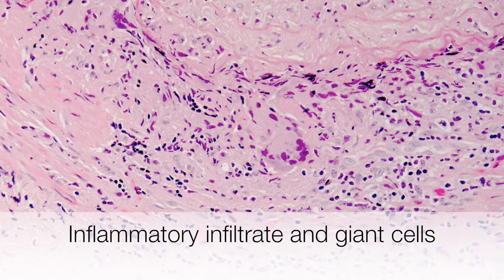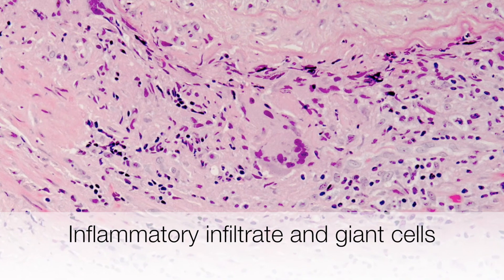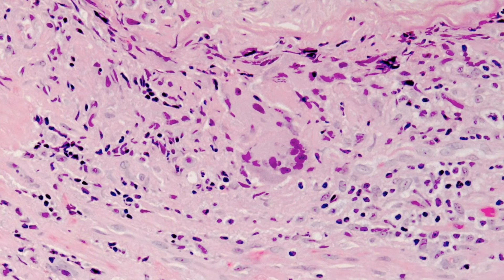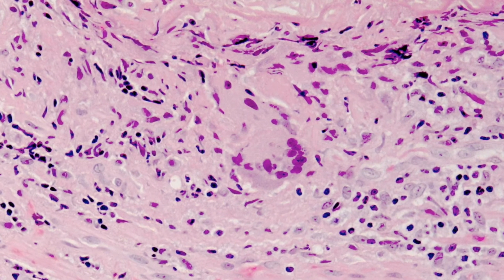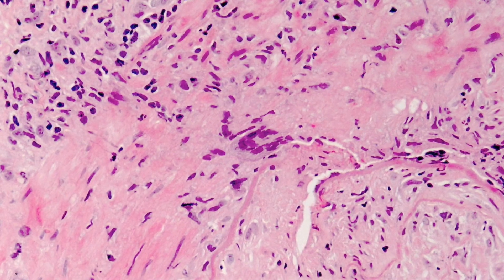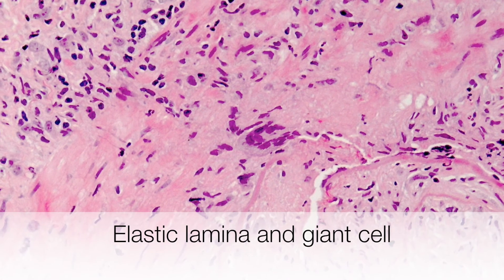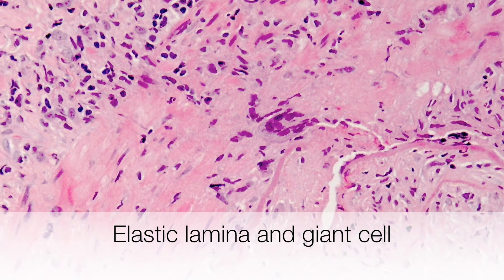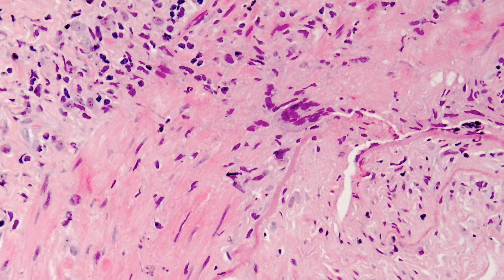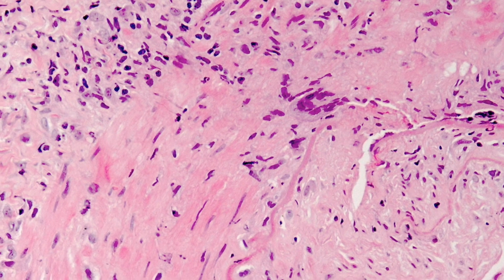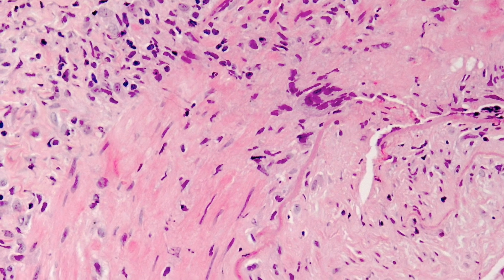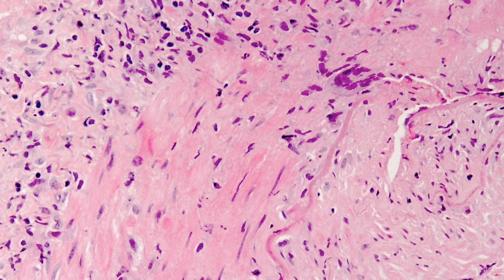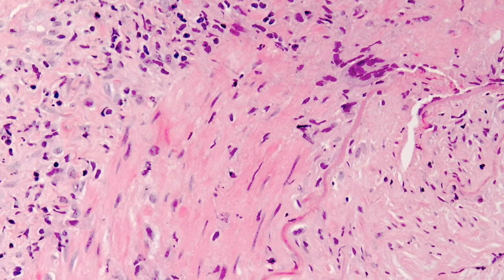Here the lymphocytes and histiocytes can be more clearly seen, and in the middle of the picture is a giant cell. The giant cells tend to be situated adjacent to fragments of the elastic lamina. In this picture you can see a giant cell, and beneath it, running to the bottom of the picture, is a squiggly red line — this is the elastic lamina.